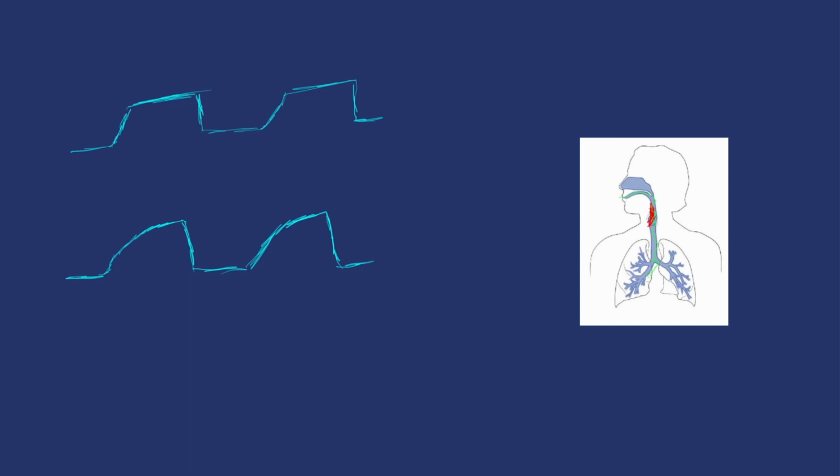This is our shark fin capnography, and this is a sign of some kind of airway compromise or obstruction. And in the cases of airway obstruction, more often we see this with something such as sleep apnea or central sleep apnea. But we may also see it if somebody has, say, bronchospasm, or if they're having an allergic reaction where we're doing procedural sedation inside a cath lab, or if you're in an ICU. Again, really important to look at.